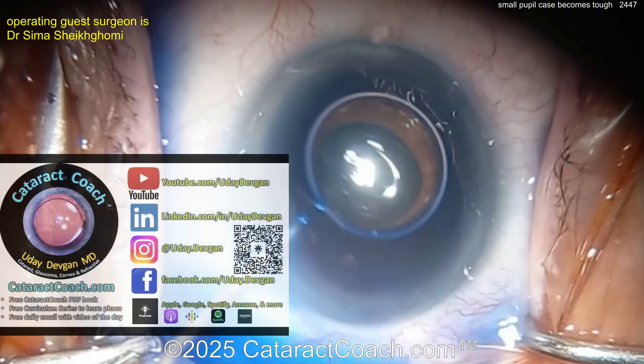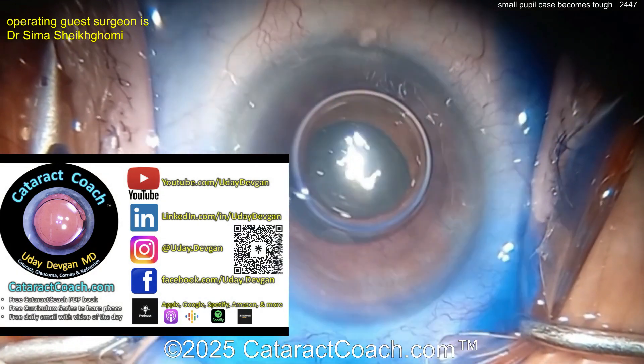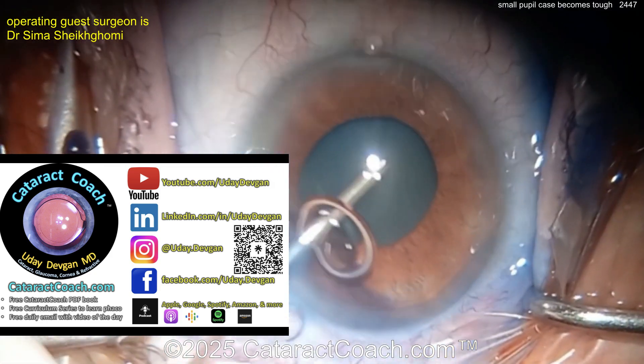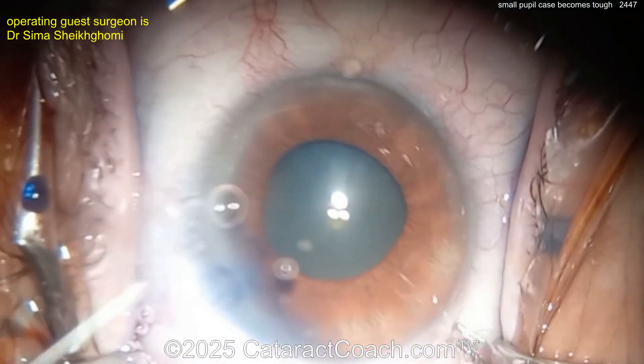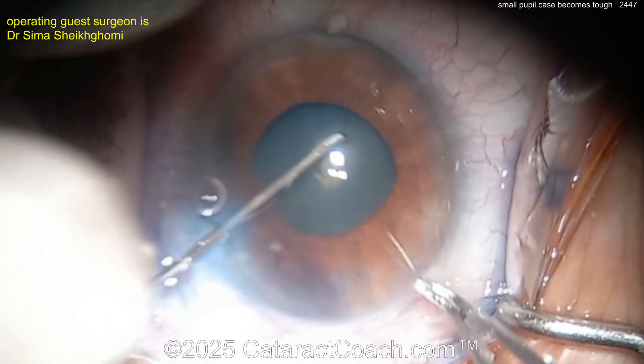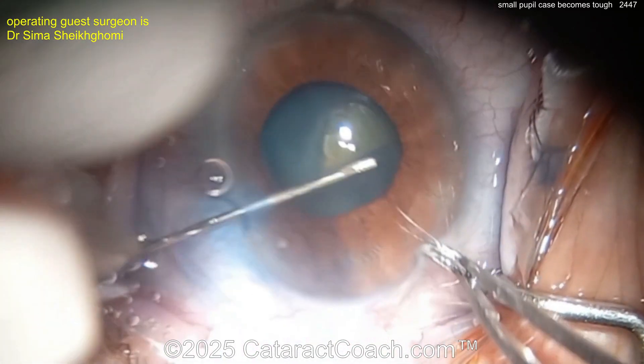Check out the Cataract Coach podcast — the top podcast in all of ophthalmology. Now here we go: got some viscoelastic inside the eye, using a sinskey hook, getting a rhexis created here.